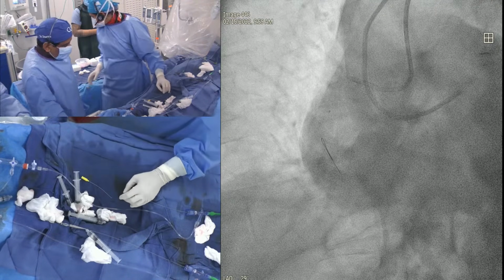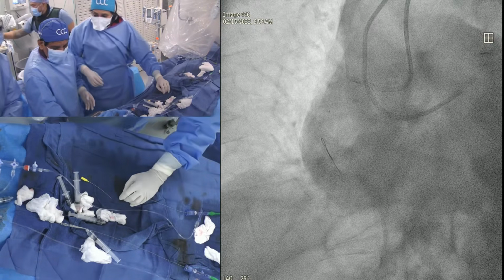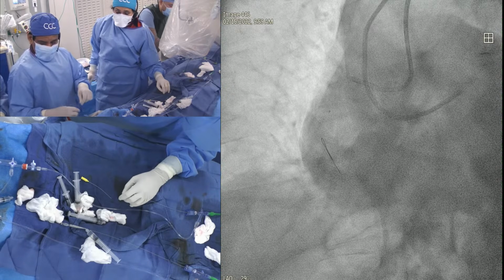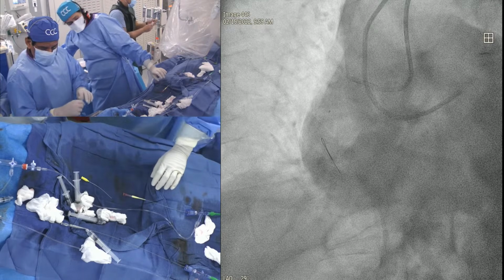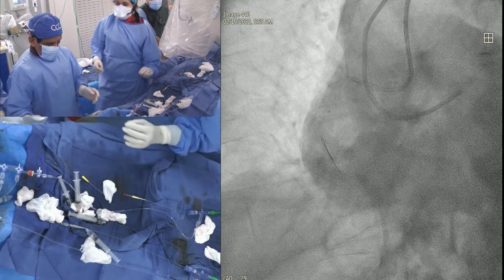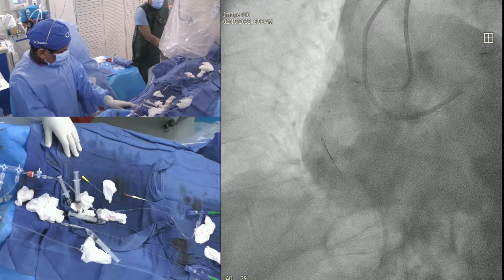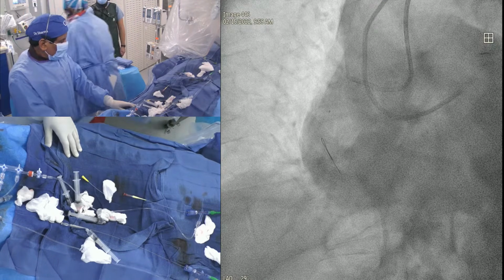Yeah, done. What do you want now? You keep talking. I want to try one more thing. Which wire? We have to find our new wire. The Miracle 6 are gone. New Miracle 6. Get me quickly. Okay. Oh, you have that other one? So let's see. What is that? What is it? So I would say that is same.